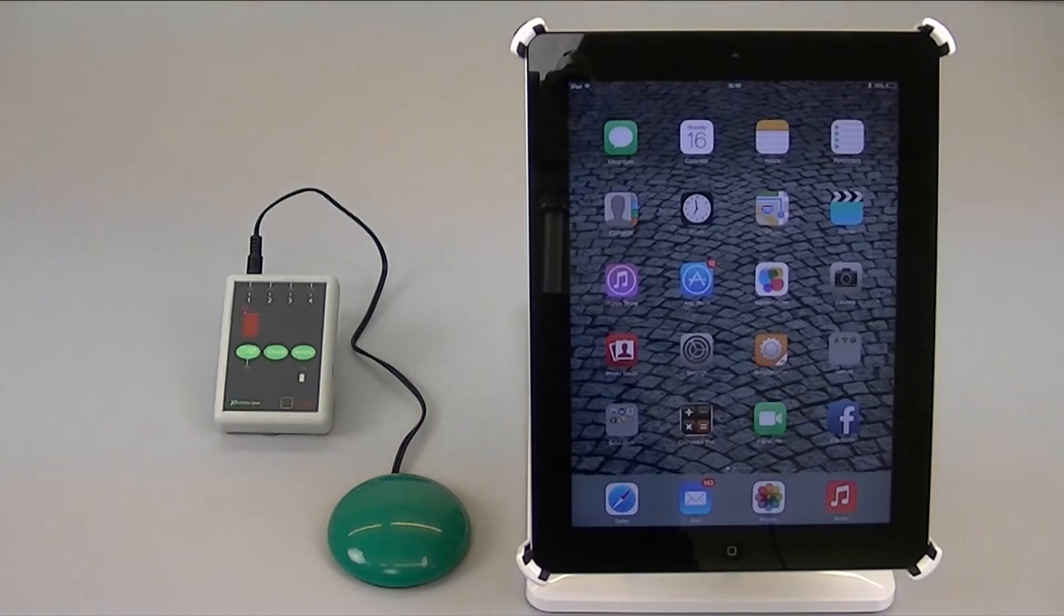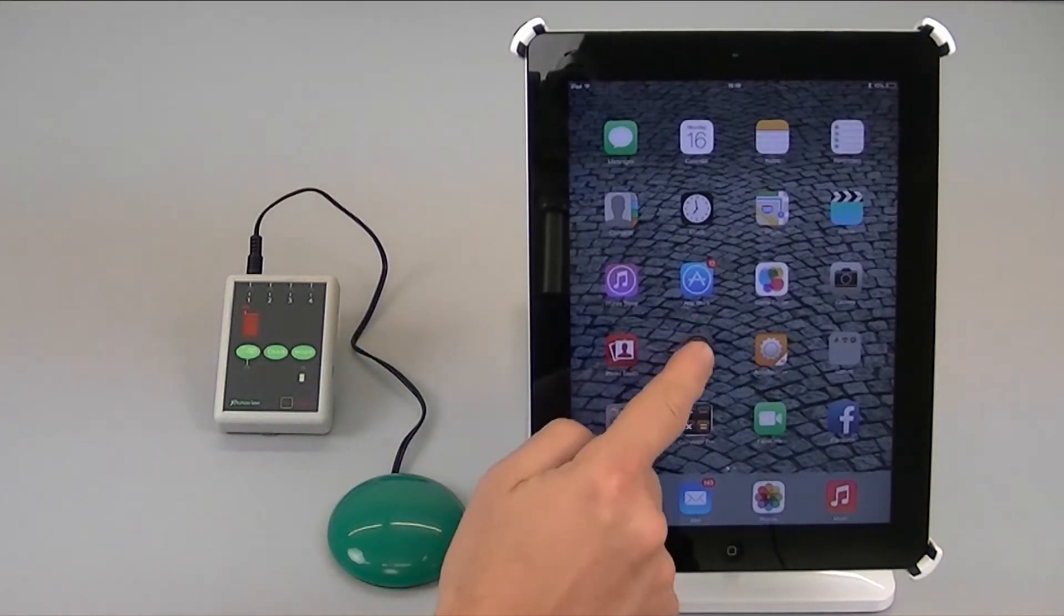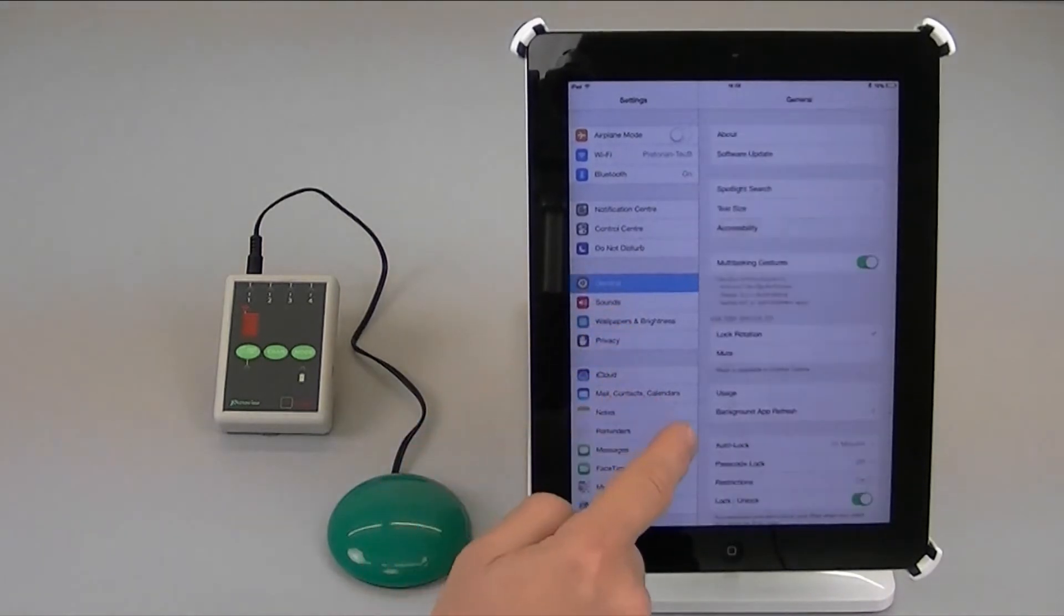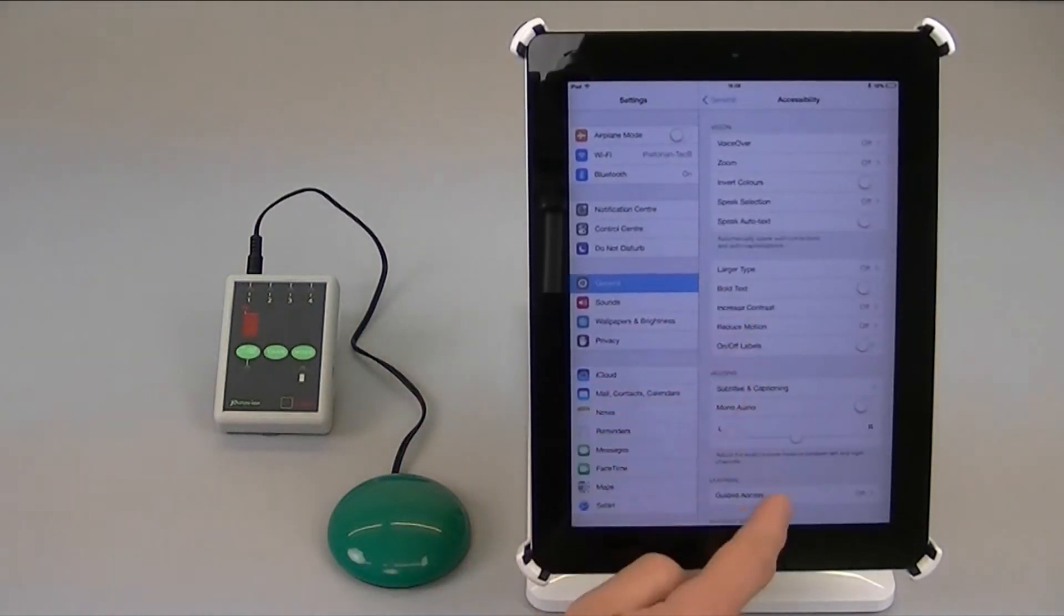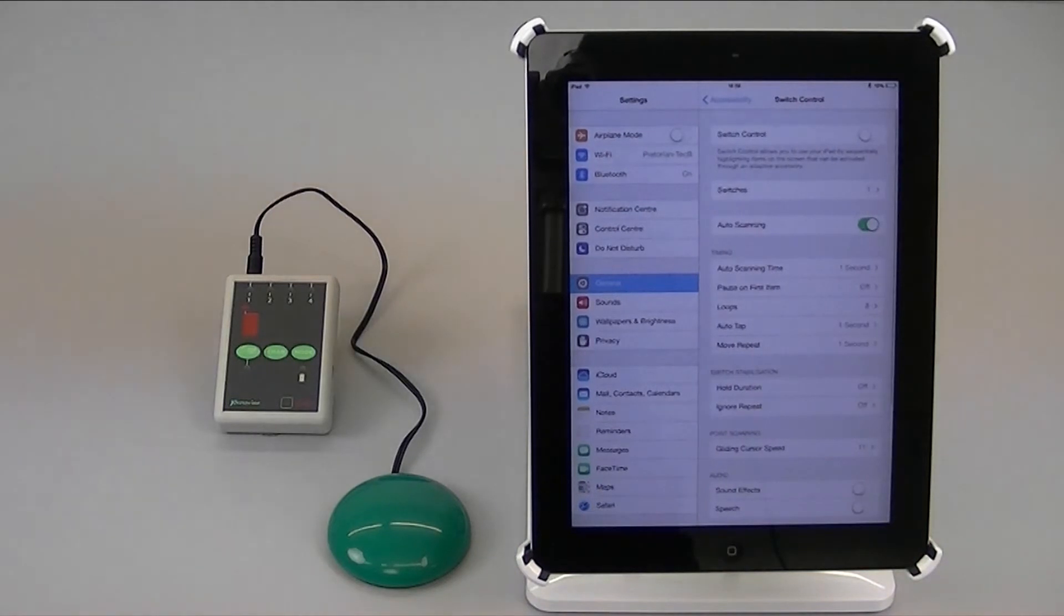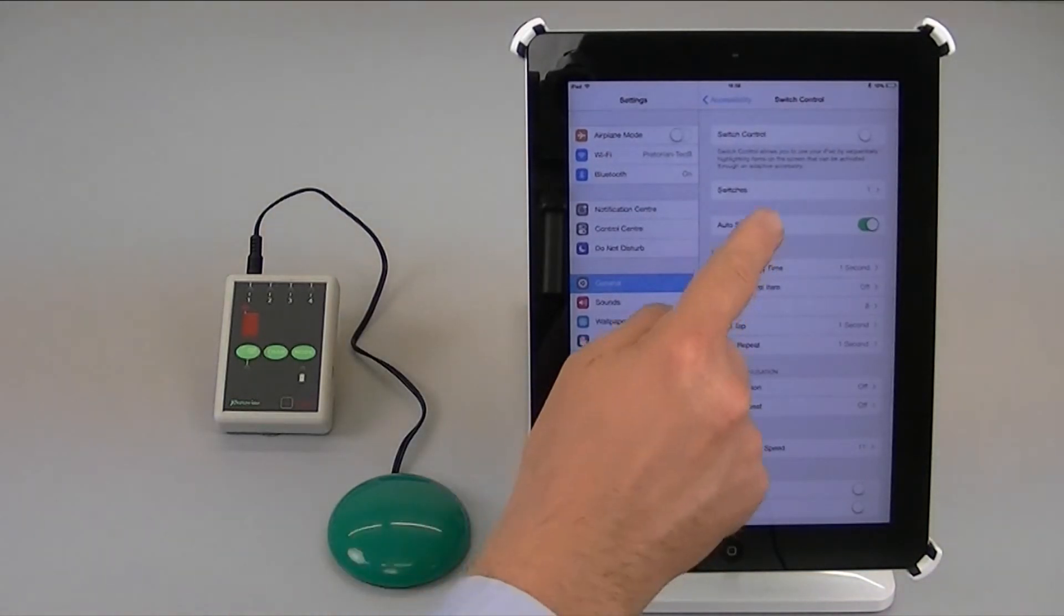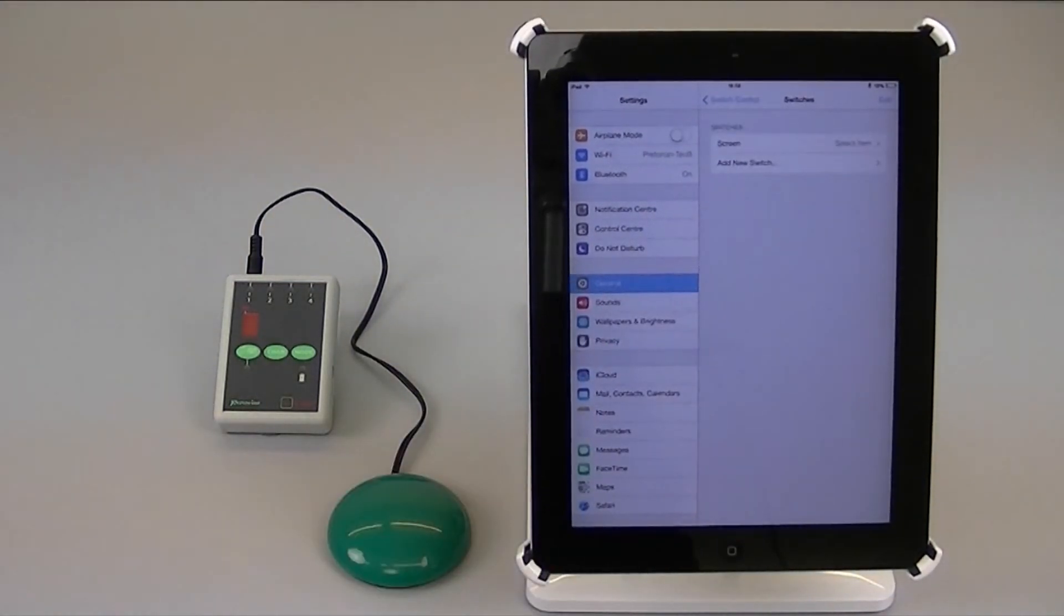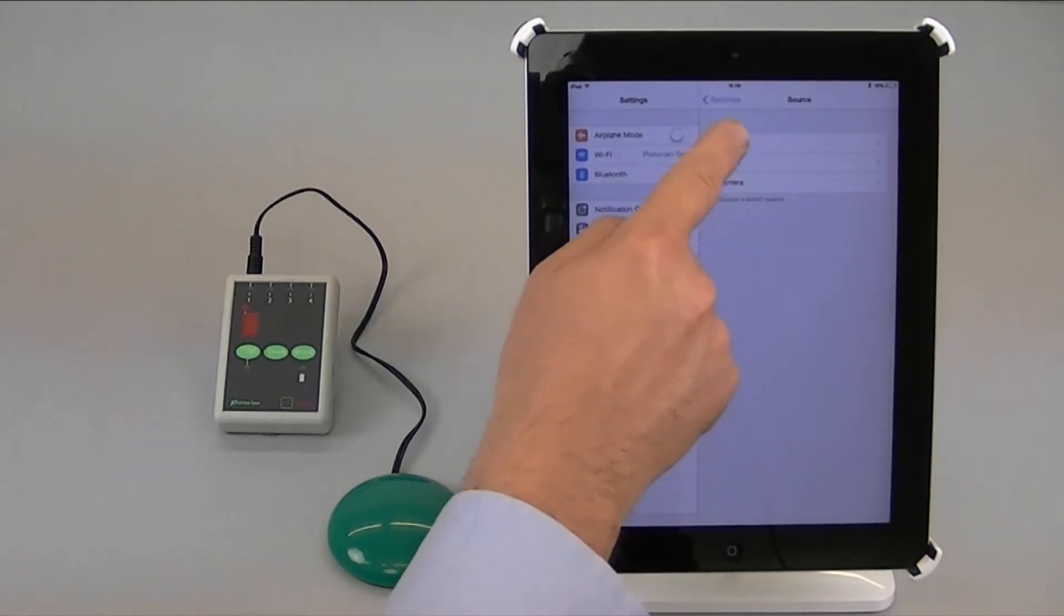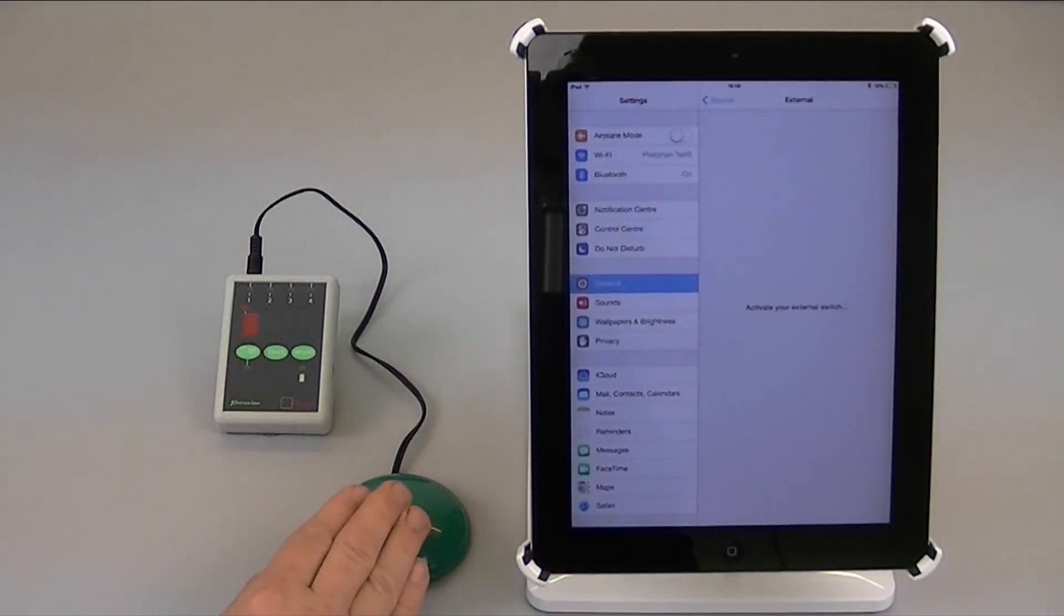To set it up I go into settings, general, accessibility and switch control as usual. I set up a switch which is external and I'm going to press the switch briefly.